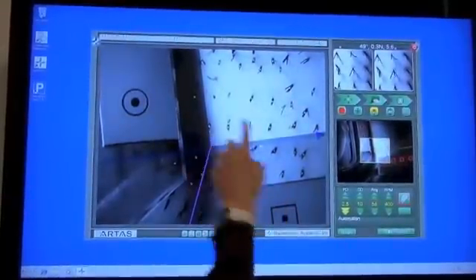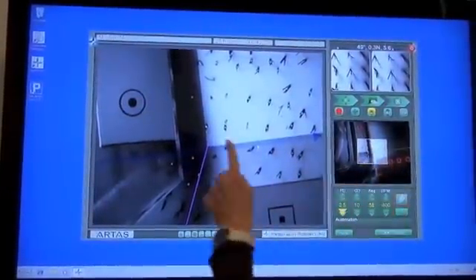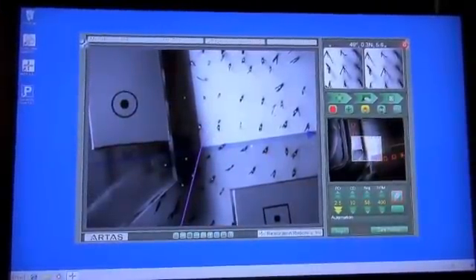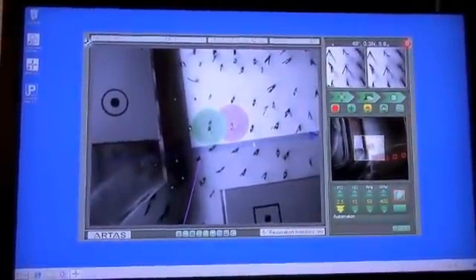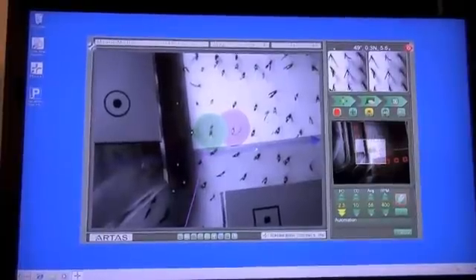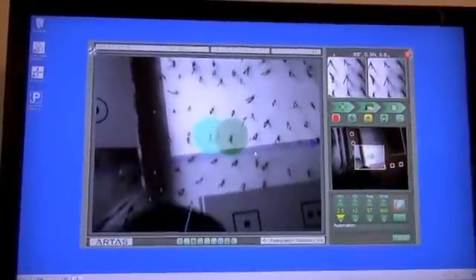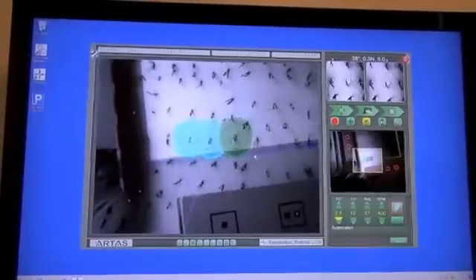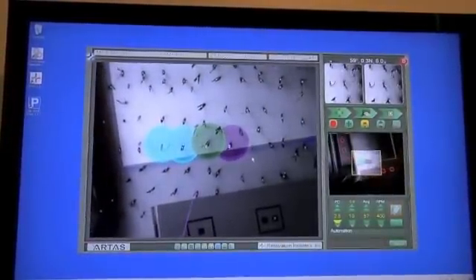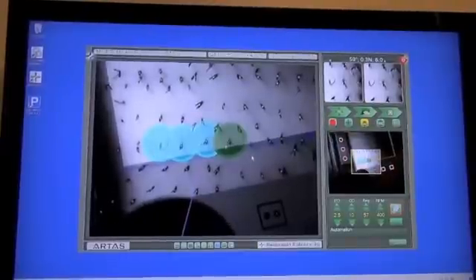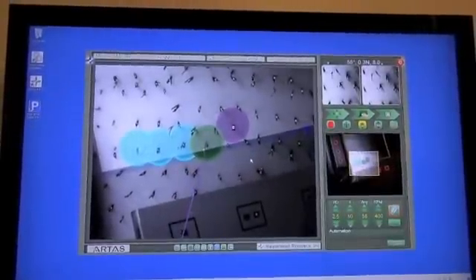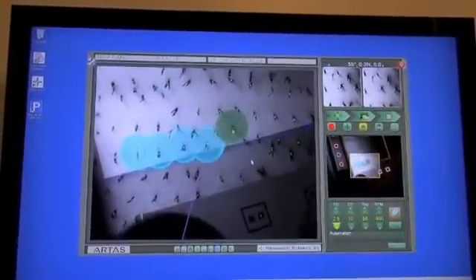This is the bottom of that grid. This is where it starts. When we begin, the system looks at the hair, lines up to that hair, and performs the dissection. The green circle indicates the present, the purple is a preview of the future dissection, and the blue one is the past dissection.